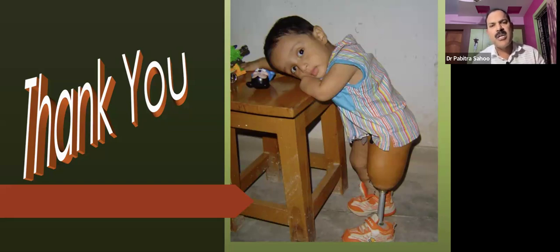The patient may have an abducted gait, or any type of gait deviation, because in a prosthesis the hip is very close to the spine. Whatever gait deviation there is will affect the hip joint, and once the hip joint is biomechanically affected, it indirectly affects the spine also. So the commonest problem the patient has is lateral trunk bending. Prolonged excessive lateral trunk bending can give rise to back pain in the long run.